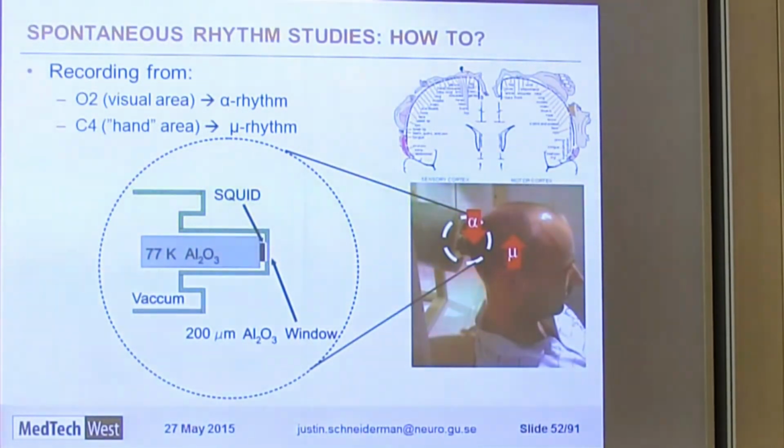Well, we didn't stop there. So the next signal we thought we'd try looking for is what's called the somatosensory alpha, or the mu rhythm. This is a signal similar to the alpha rhythm that's attenuated when you're receiving somatosensory inputs. So if you're feeling some stimulus on your hands or other parts of your body, or if you're controlling them in some way, these signals are attenuated. But when you're not receiving somatosensory input and you're not providing motor control for your hands, for example, then the signal is stronger.